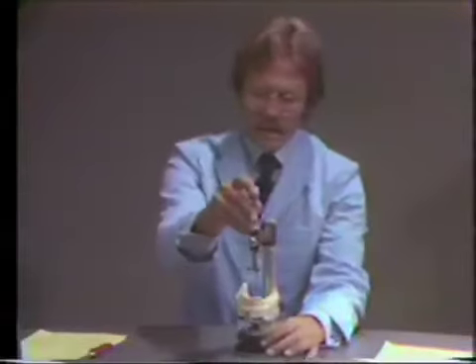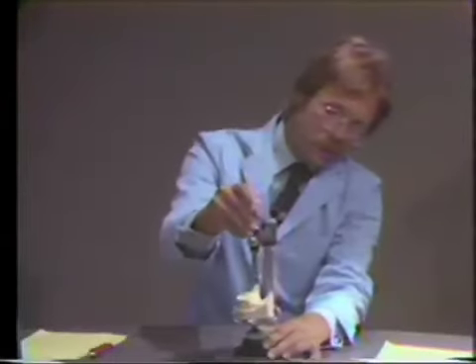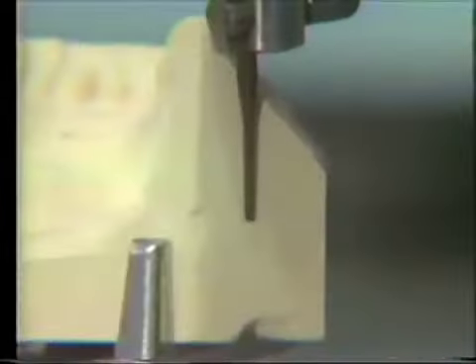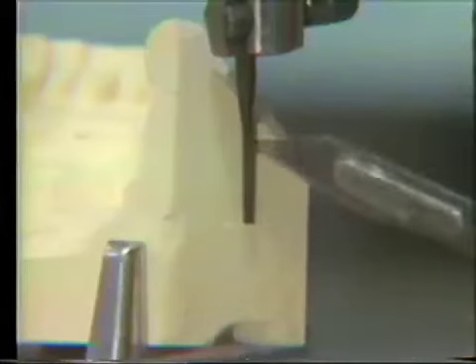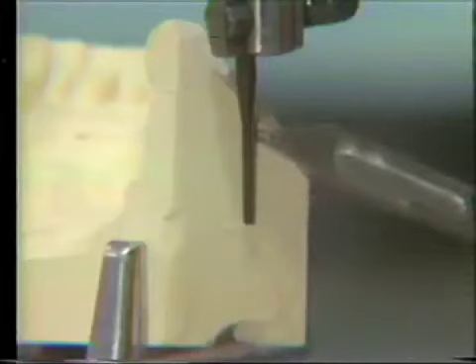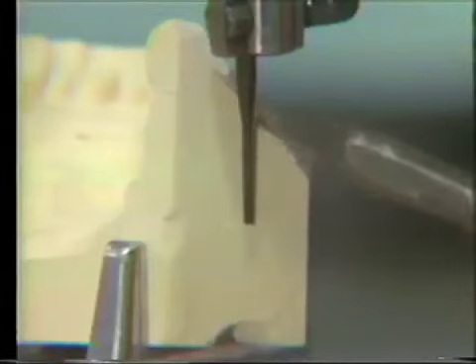So I'm going to mark the cast by etching it with a sharp instrument. I'm going to mark the cast in two planes so that I can reposition the cast in this position. This merely will be taking an instrument and going along that analyzing rod of an adequate length.